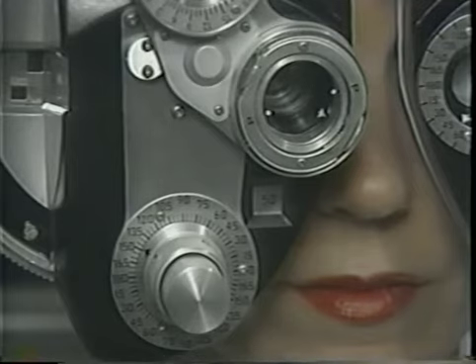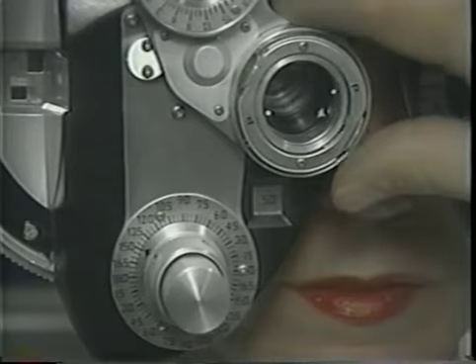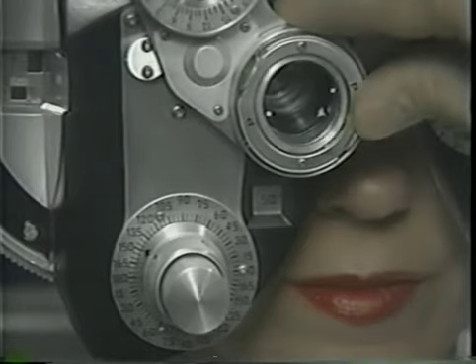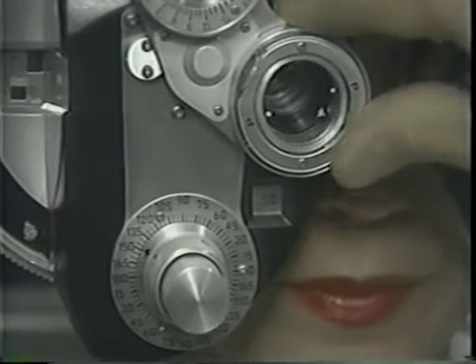Here, the plus cylinder axis of the phoropter was moved toward the white plus cylinder axis of the cross cylinder. If the phoropter were a minus cylinder model, the cylinder axis would have been moved toward the red minus cylinder axis of the cross cylinder. Which is better now, 3 or 4? 3 or 4? 3.